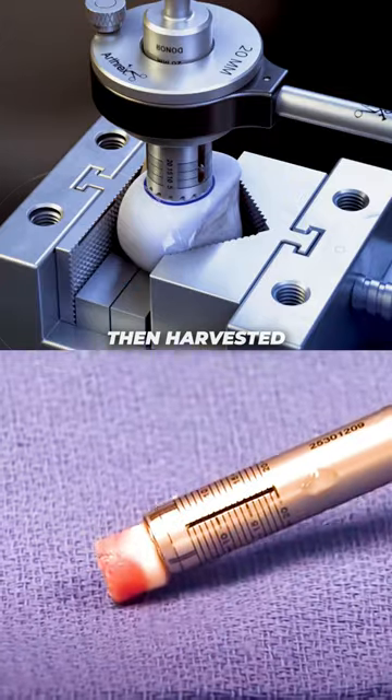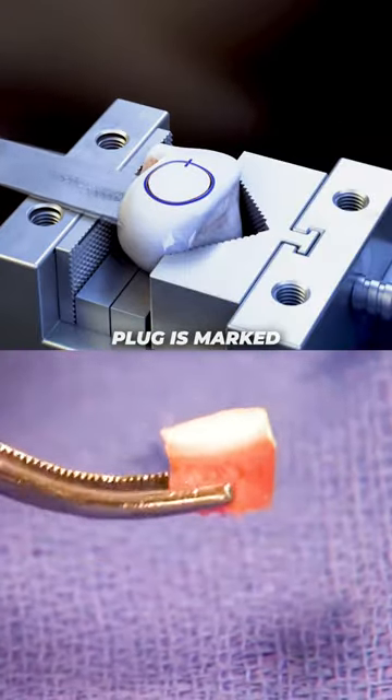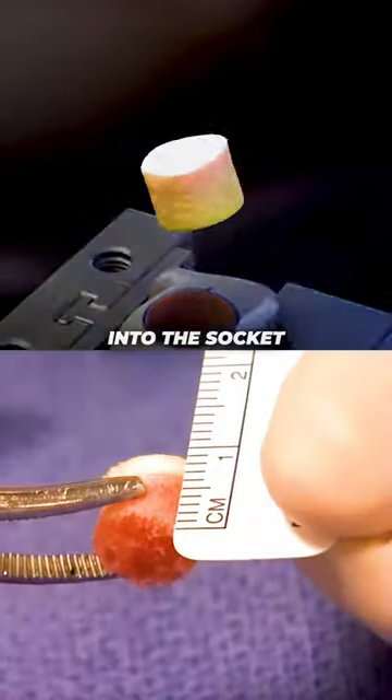Donor cartilage is then harvested to match the size and contour of the lesion. The graft plug is marked and prepared to fit snugly into the socket.